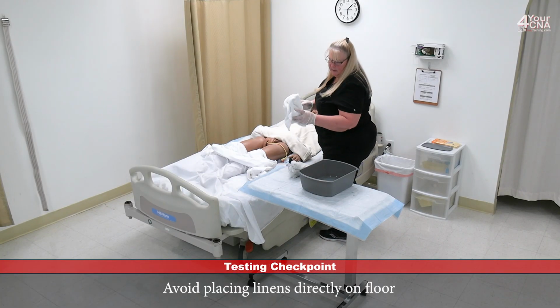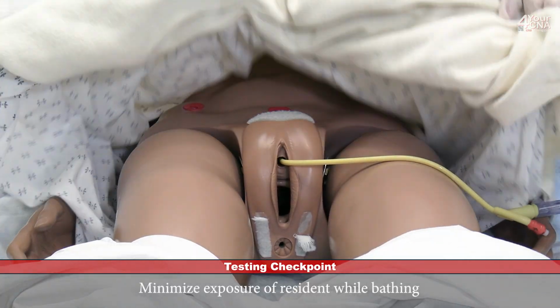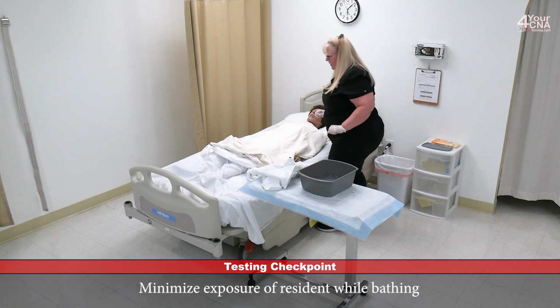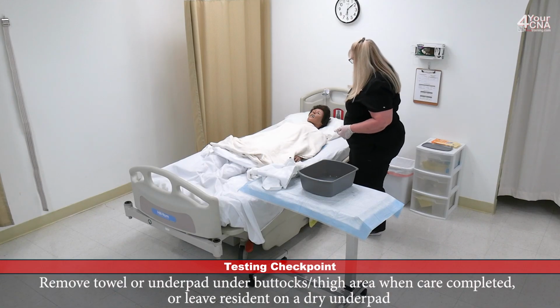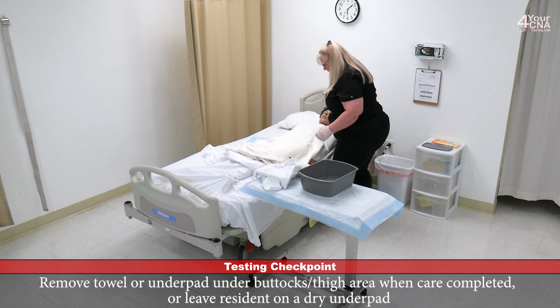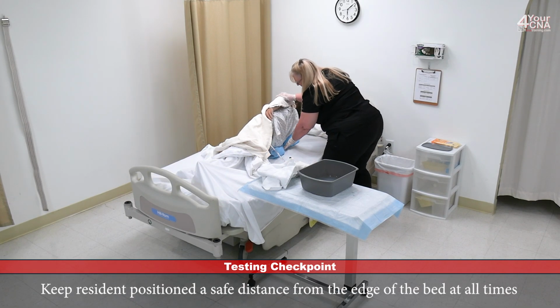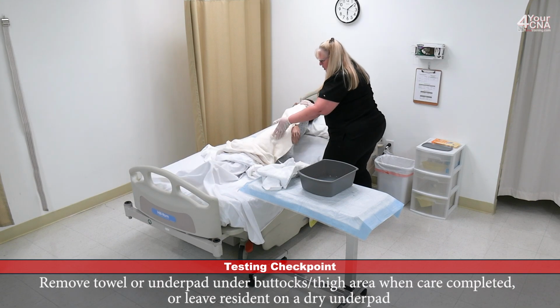We can remove the towel, set it on the table, and we're going to unroll the privacy blanket, trying to be careful not to touch that gown with your soiled gloves, and we'll cover the patient up. Mrs. Jones, can I get you to scoot toward me, and I'm going to remove the pad that's under you. Go ahead and scoot toward me, and on the count of 3, you're going to roll up. 1, 2, 3. I will roll the soiled chucks toward the patient and tuck it underneath her hip. Come on back, Mrs. Jones.